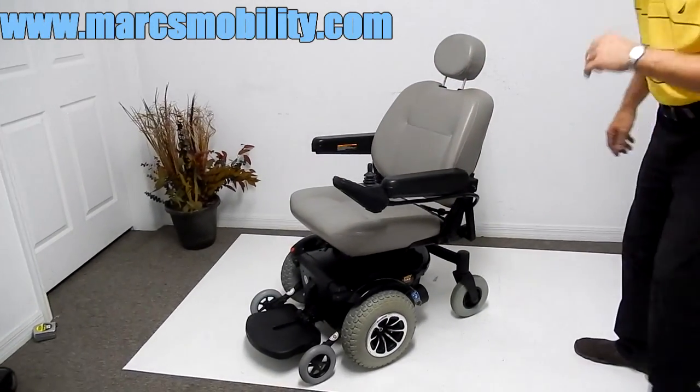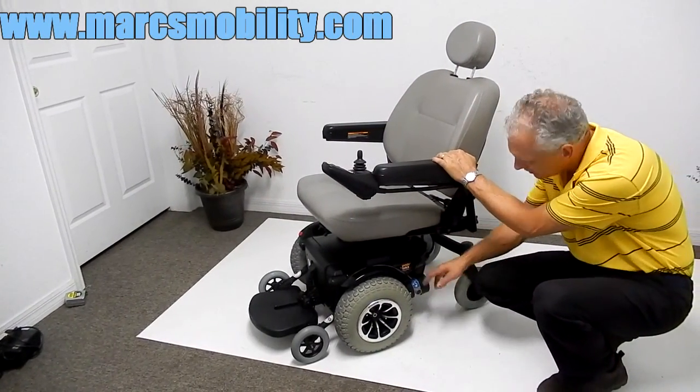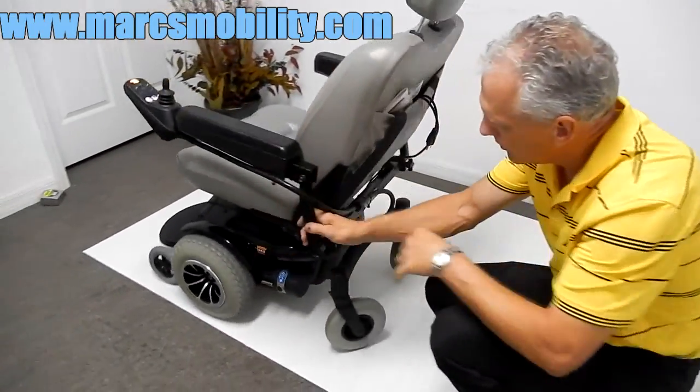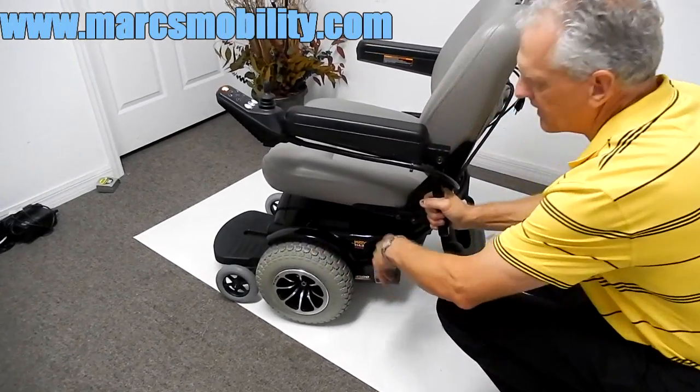If you need to put this chair in neutral, you have two motors — one here and one on the opposite side. There's a handle right on top of the motor. When I pull the handle out, the motor is in free wheel, very easy to move around. Pull it back in and the wheel is locked again.